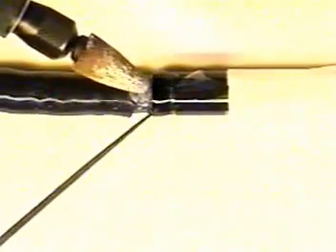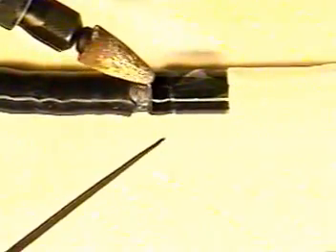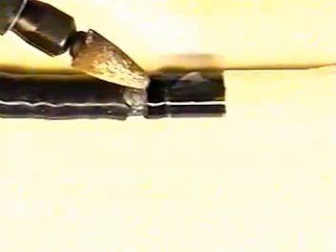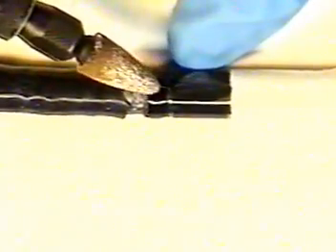Cut into the bending rubber partially to remove some of the old bending rubber, which will allow us to gain access to the other half of the glue joint. Again, using our Dremel tool or file, we will remove a small thin layer of glue from the endoscope without cutting deeply into the insertion tube, right above the Scotch tape line.